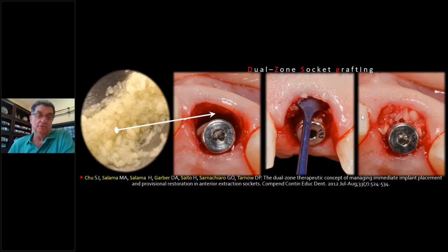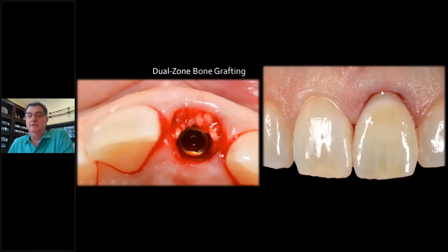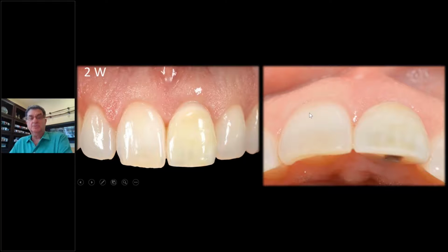Now I have the temporary already. And now the temporary has been stained, and I put it back on, and any excess gets squeezed out. And this is socket seal, prosthetic socket seal. Paul Weigel put that wonderful term, prosthetic socket seal. And that holds the graft in place. And now the implant is to the palate. I've got a graft in the gap, which we'll talk about in a minute. The buccal plate is intact, and minimally invasive surgery. Take a look. Beautiful. So the patient walks out that way.